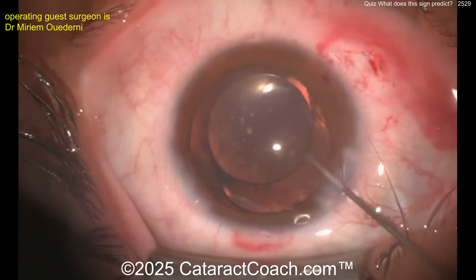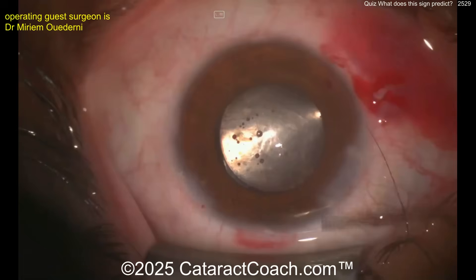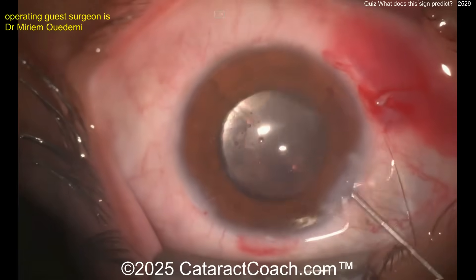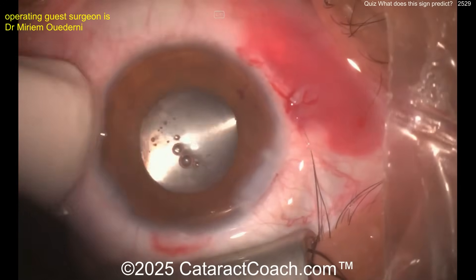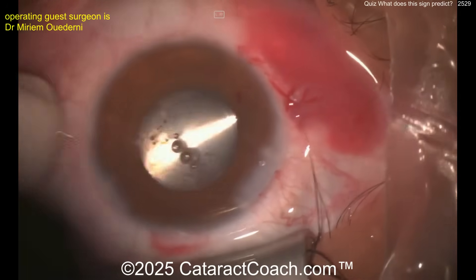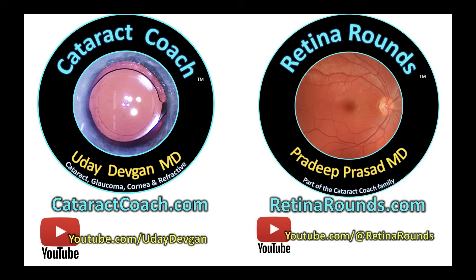Is there total global zonulopathy? You could kind of end the case here and come back later — which is what we're going to do. If the lens does descend, or later you need a second point of fixation, you can always put a suture around that CTR 180 degrees opposite the eyelet of the Cionni ring. Very interesting case — I hope you got the quiz right. Always fun to learn from great surgeons. Beautiful result. Remember, check out the Cataract Coach website and of course retinarounds.com.